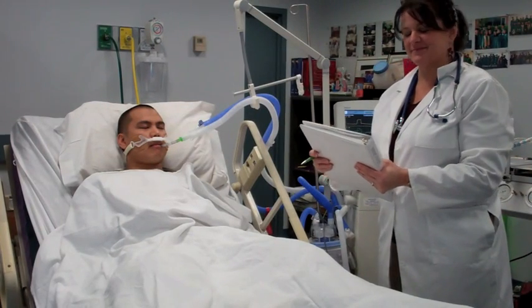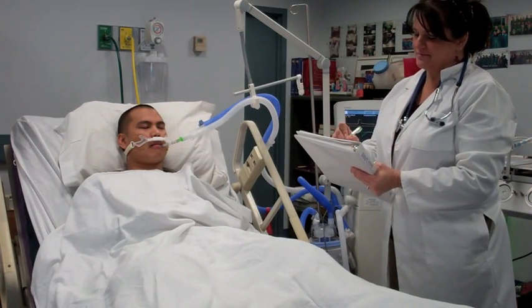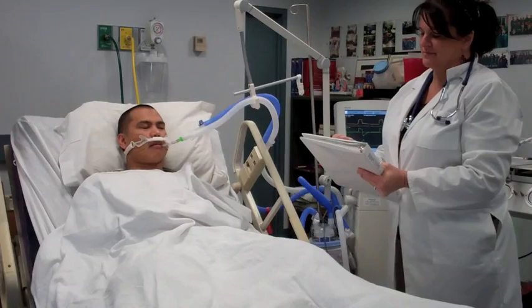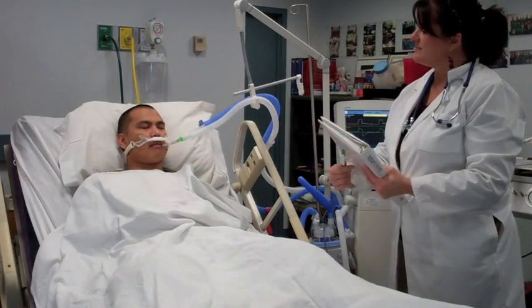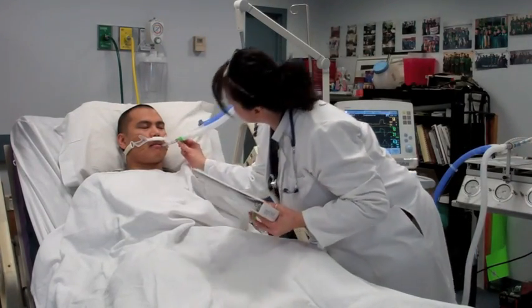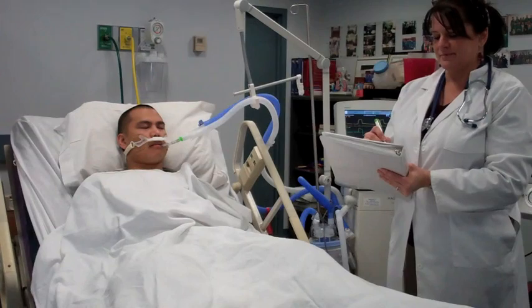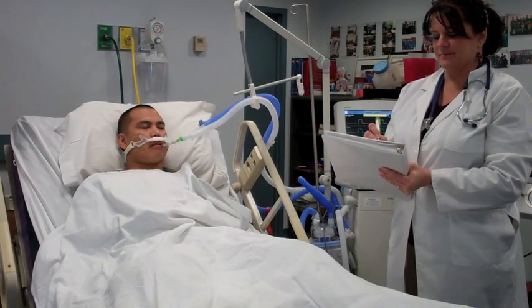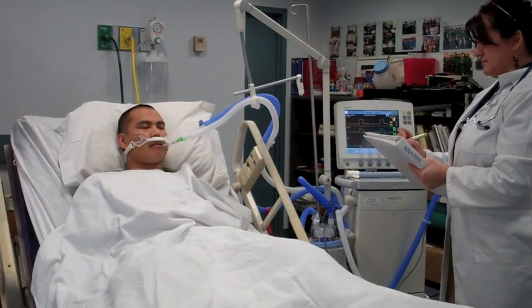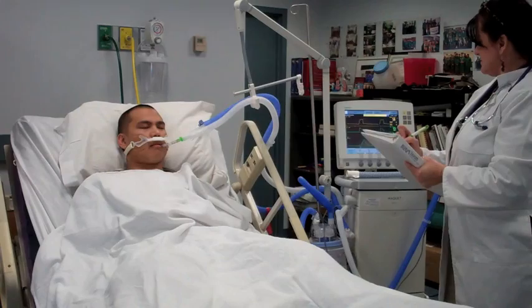Today we are going to show you how to set up Auto Mode on the Servo I. Auto Mode is a good mode to start weaning a patient on since it has the benefit of backup support. There are three different modes of ventilation Auto Mode may be added to, including PRVC, volume control, or pressure control.